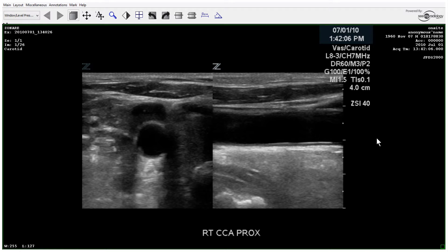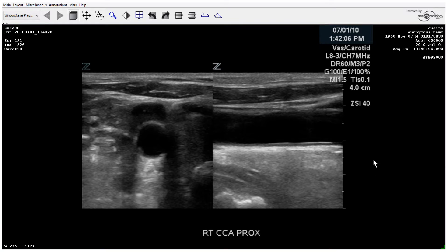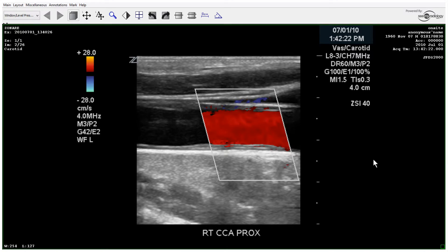For this case, we have a patient who has a history of a CVA. The sonographer starts out with a dual-screen image of the common carotid proximally in both transverse and long axis, and there's a color image.